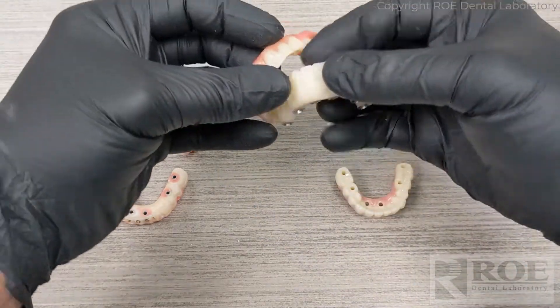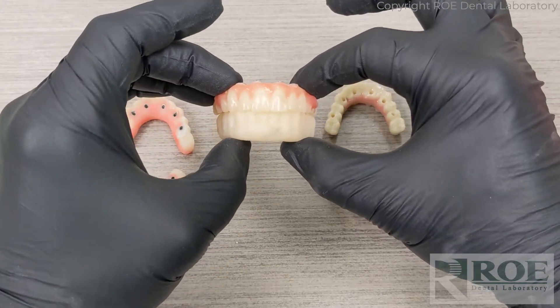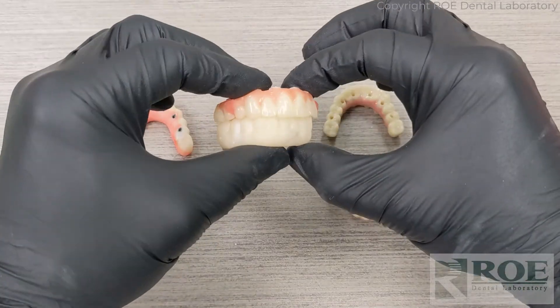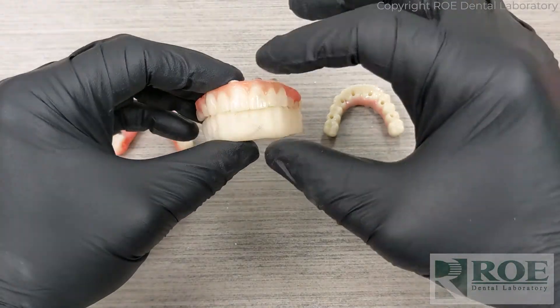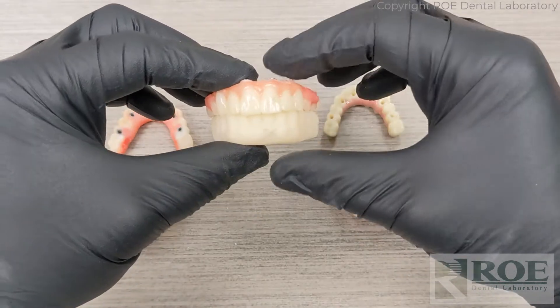A little bit of equilibration was done overall just to make sure the case was perfect, and then the case was sent in for final restoration. On this case, the lower is monolithic and monochromatic, and the upper has pink. There is a slight additional charge for the pink, but it allows the patient to better visualize the aesthetics.